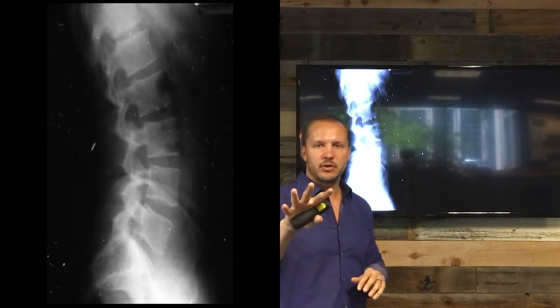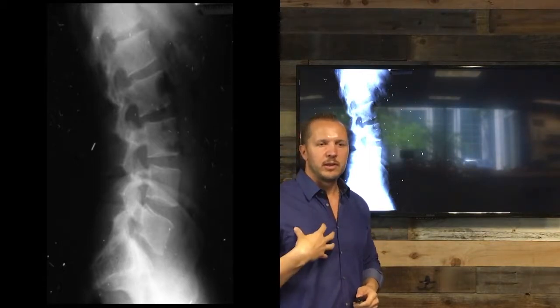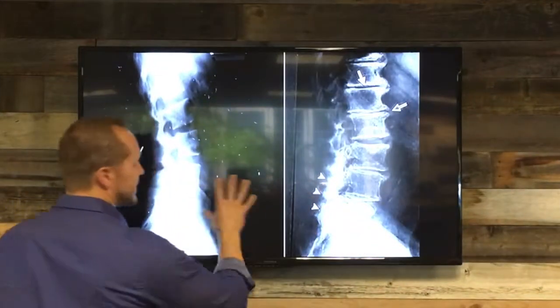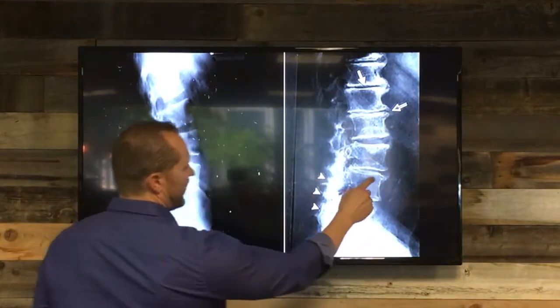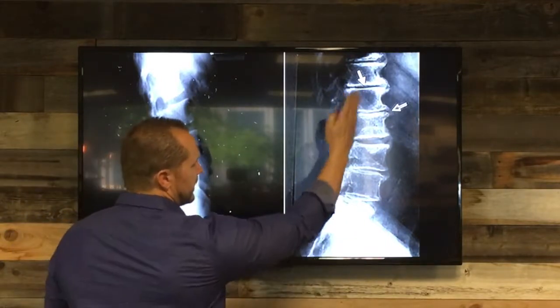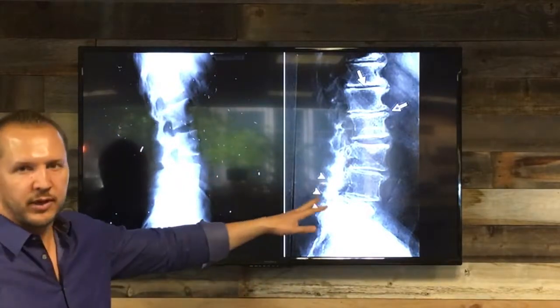But we didn't take that picture of you. We didn't want to do too many x-rays of you. But in the future, if I believe that's necessary, we may take that additional image. But let's continue on. So you can see this is a picture of someone with not a very healthy lower spine. So we've got decreased disc spacing compared to what they should be. We have shifts in the alignment. We have bone spurring going on. A lot of trouble, a lot of degeneration.